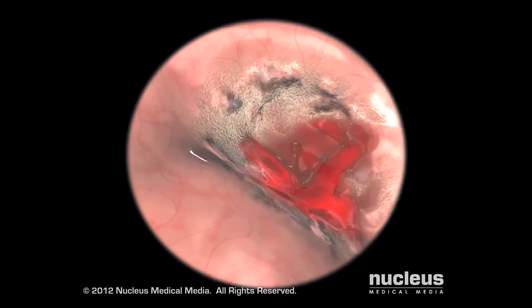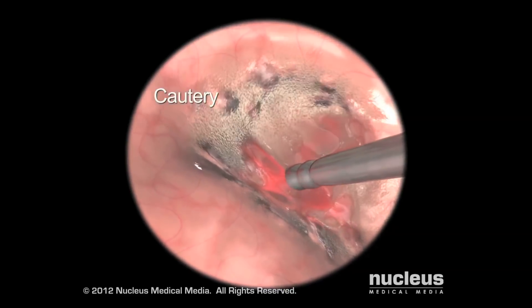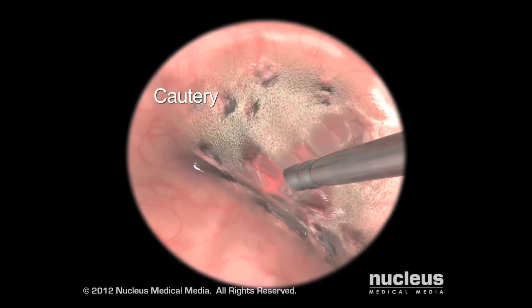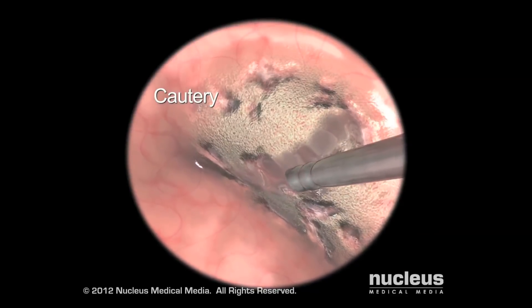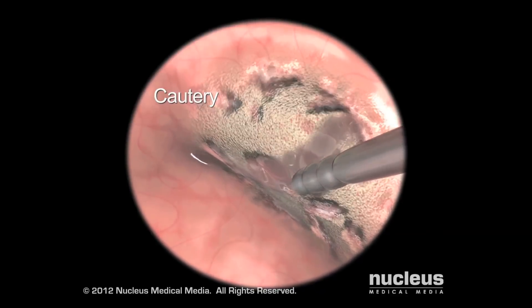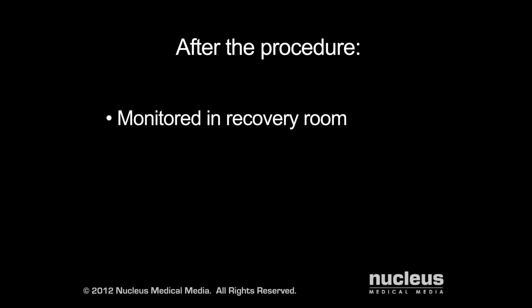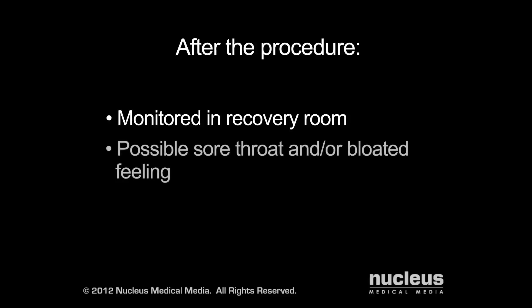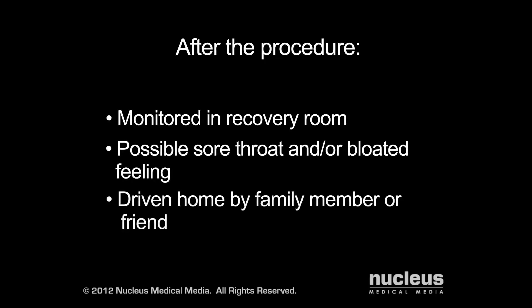Your doctor may also use the endoscope to treat a problem such as an actively bleeding ulcer or to stretch open a stricture or narrowing in the esophagus or stomach. After the procedure, you will be monitored until the effects of the medications have worn off. Your throat may be sore and you may feel a bit bloated. You will need to arrange for a ride home afterwards.